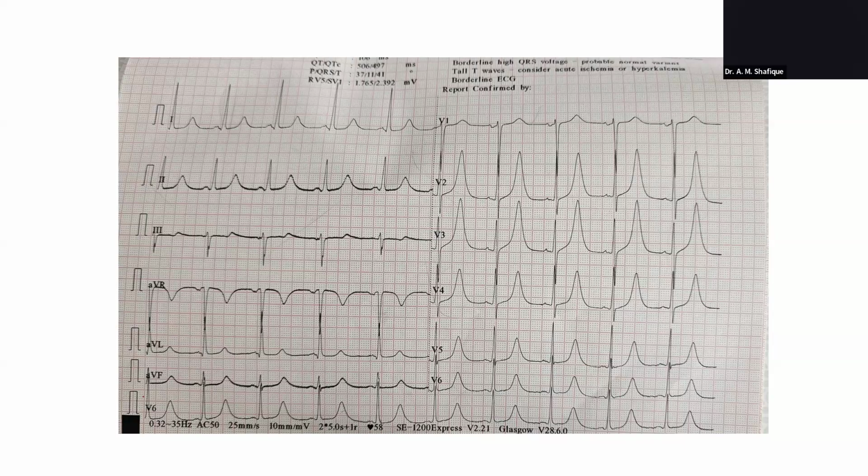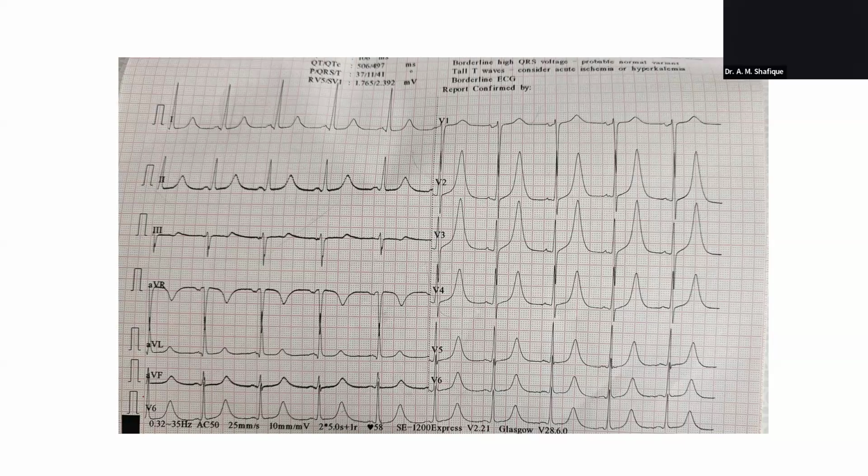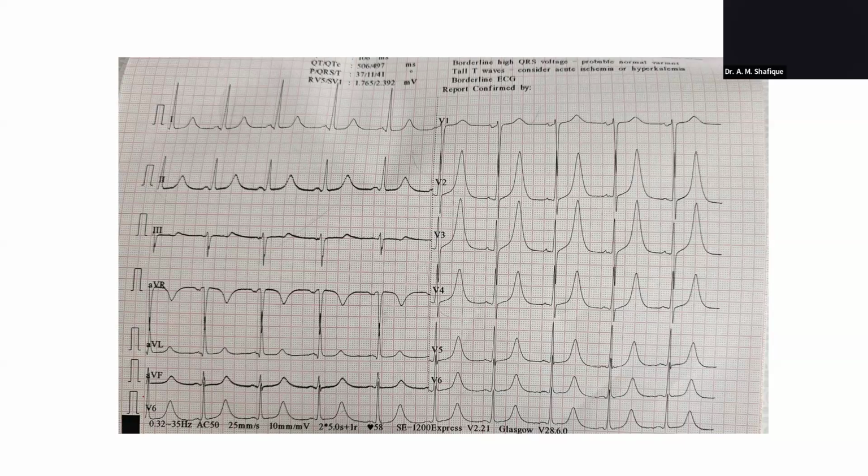Still the T wave was there. The peaked T wave was there, and that was reduced a bit. Moreover, his heart troponin level reduced from 2500 to 1500. It did not increase. So an ischemic cause in that case can be ruled out.